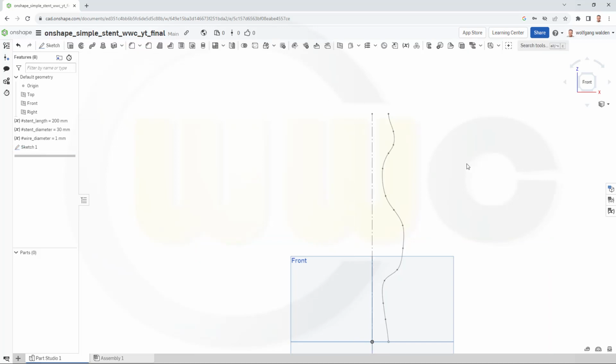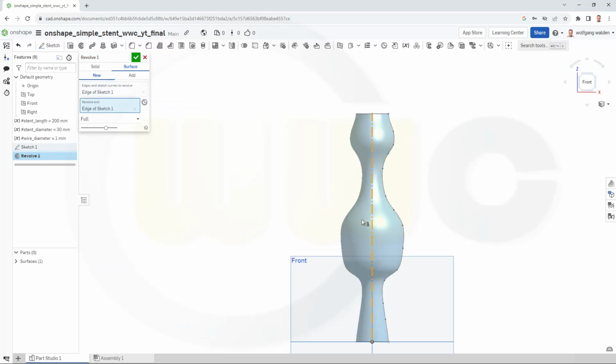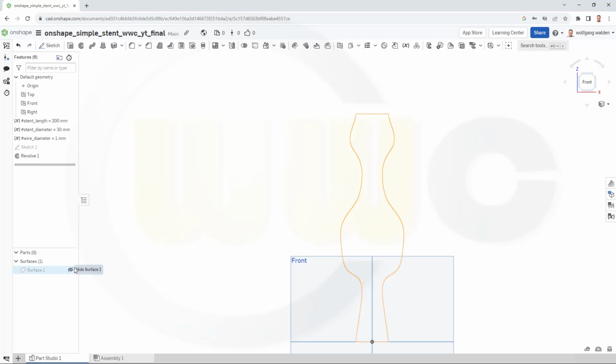I want to make a revolved surface, so let's go for a revolve. It should be a surface, yes. That would be the spline here, and the axis would be this one here. And confirm. And maybe hide that surface at least for the moment. And bring back that sketch.